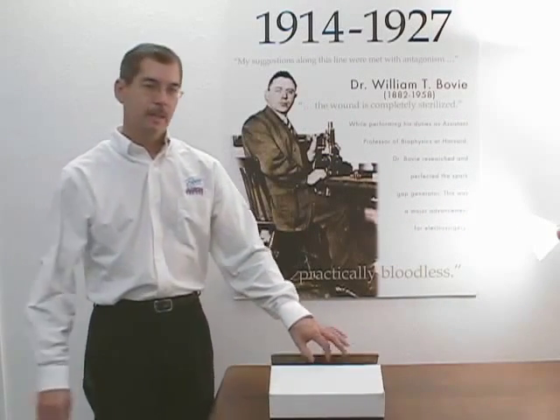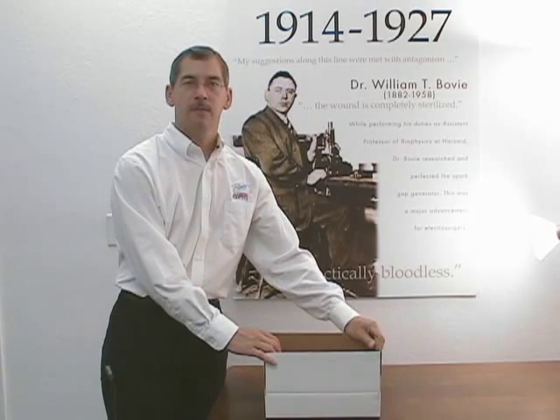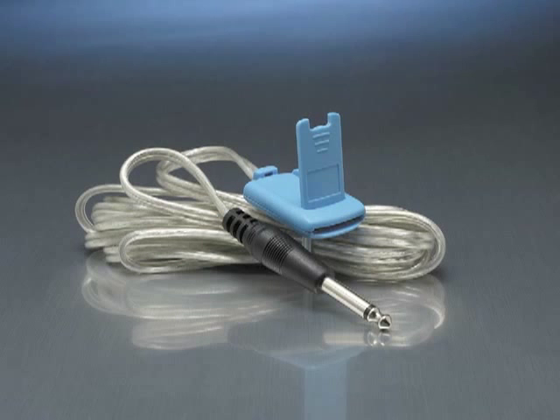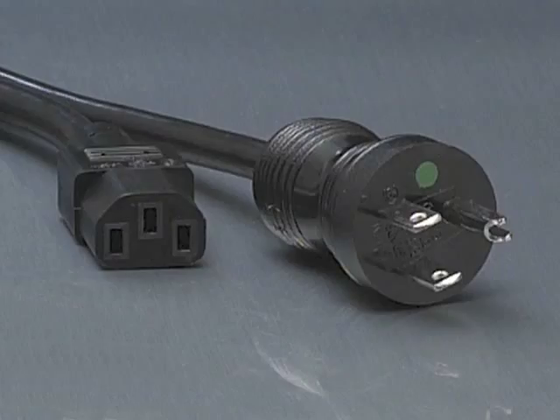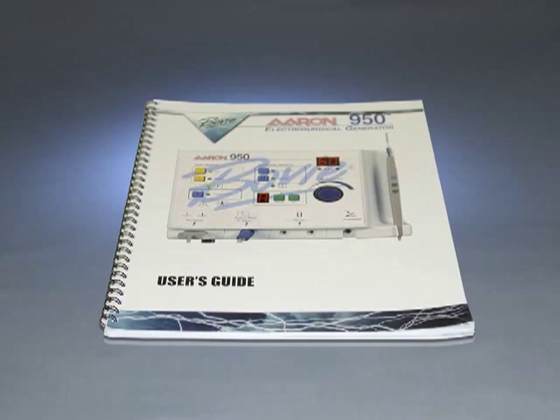As you open your kit, verify that all accessories are present and inspect each piece for damage. The accessory kit should include the following: autoclaveable 3-button hand control pencil, reusable grounding cable, 5 disposable electrodes, 3 blades, 1 needle and 1 ball electrode, a wall mount kit, 10 handpiece sheets, a hospital grade power cord, 5 disposable grounding pads, and the user's guide.